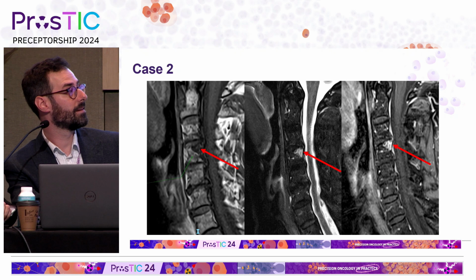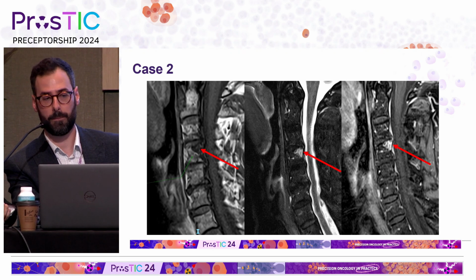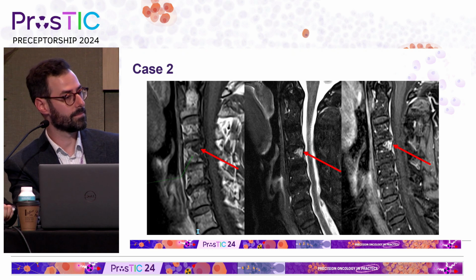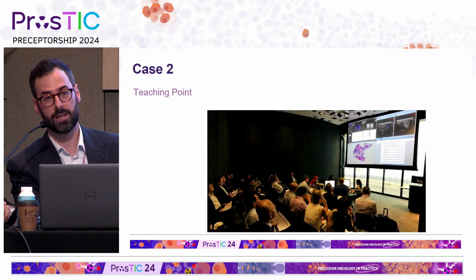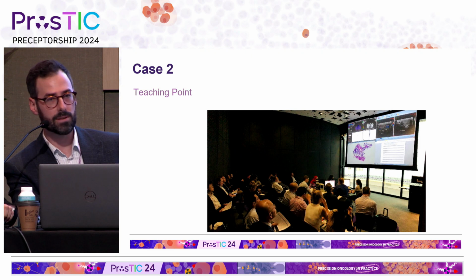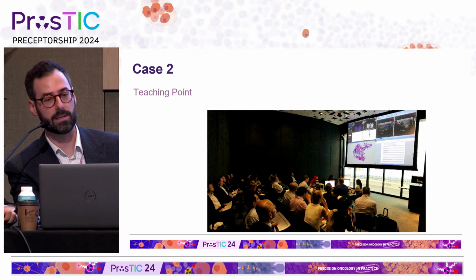Unfortunately, hemangiomas do also look like that. But, as I said, the key thing is that negative predictive value. If you've got the fat, then that's really helpful. If you don't, you have to make absolutely sure the patient hasn't had any other imaging anywhere else in the last 5 years, and try and establish that it hasn't changed over time. Sounds good. So this patient actually had a diagnostic CT, and very classic appearance. So it was more of an atypical low-fat containing hemangioma, and he went on to get radical prostatectomy with undetectable PSA.